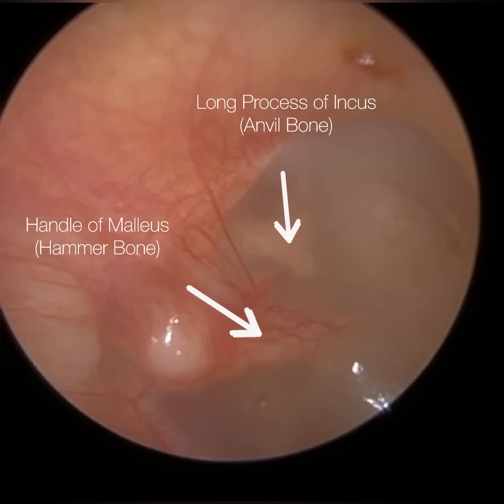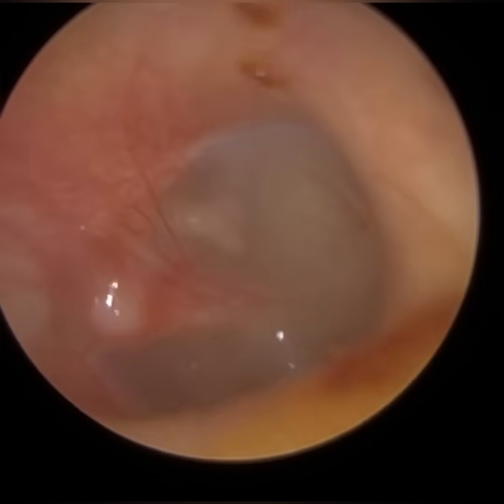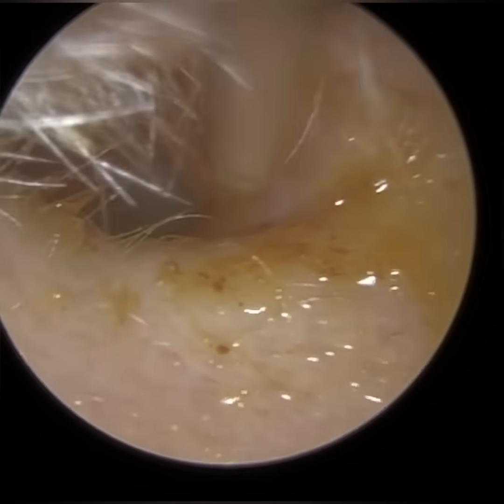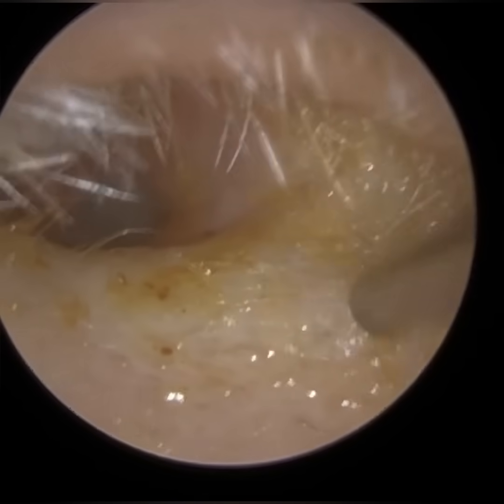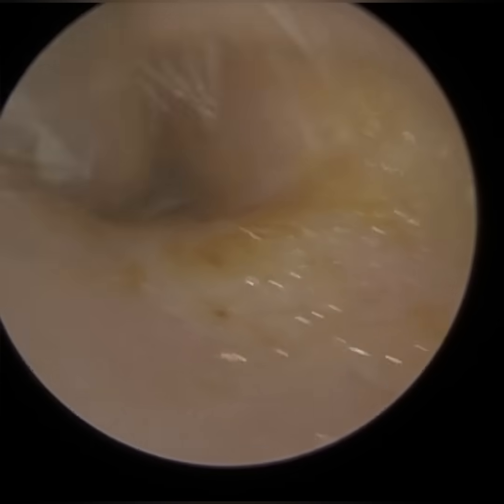I've just labelled two of the three bones in the ear. You've got the hammer bone, also known as the malleus, and that's the handle of the malleus. Then you've got part of the anvil, medically known as the incus — specifically the long process. With the hammer bone, you've got various components: the umbo, which is the section that attaches itself to the centre of the eardrum.